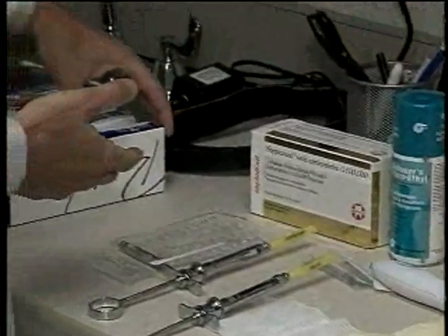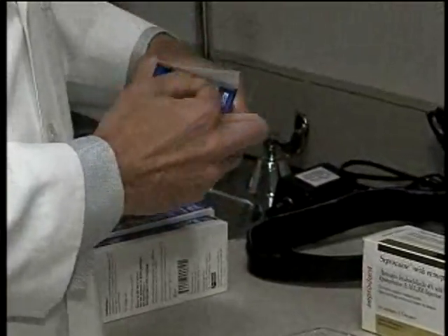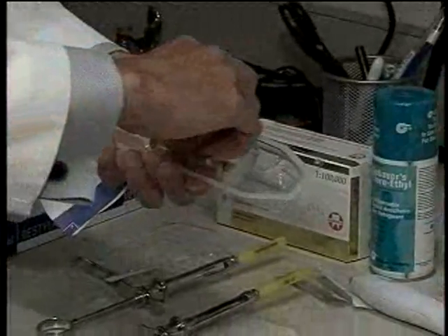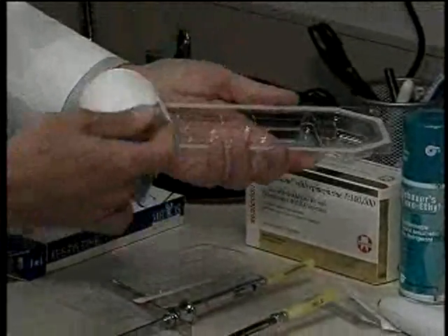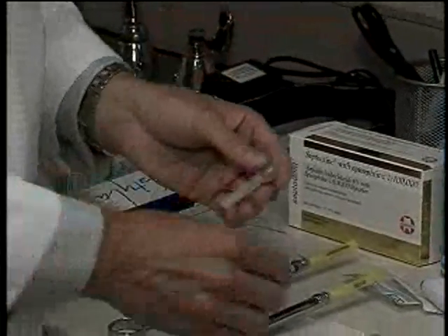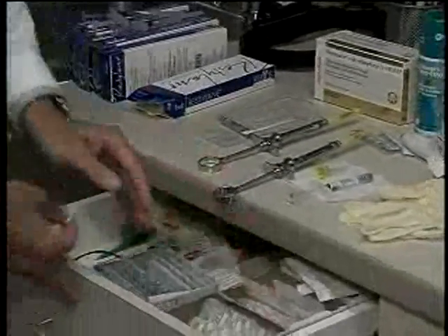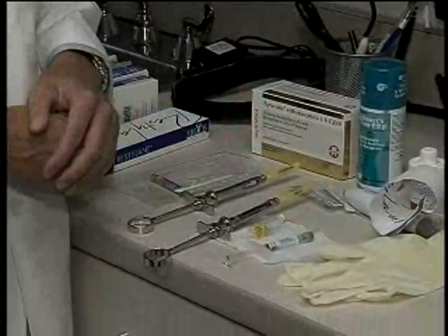To prepare the product, what I do is I take it out of the box, open the canister, and in sits the syringe of hyaluronic acid and a needle which comes with it. This needle is a 30 gauge half-inch needle, and you can use this needle, or oftentimes I'll prefer my own needle, which I like, a 30 gauge BD needle. I prefer this one, so that's what I use. Some people use the 30 gauge needle that comes with the package insert.